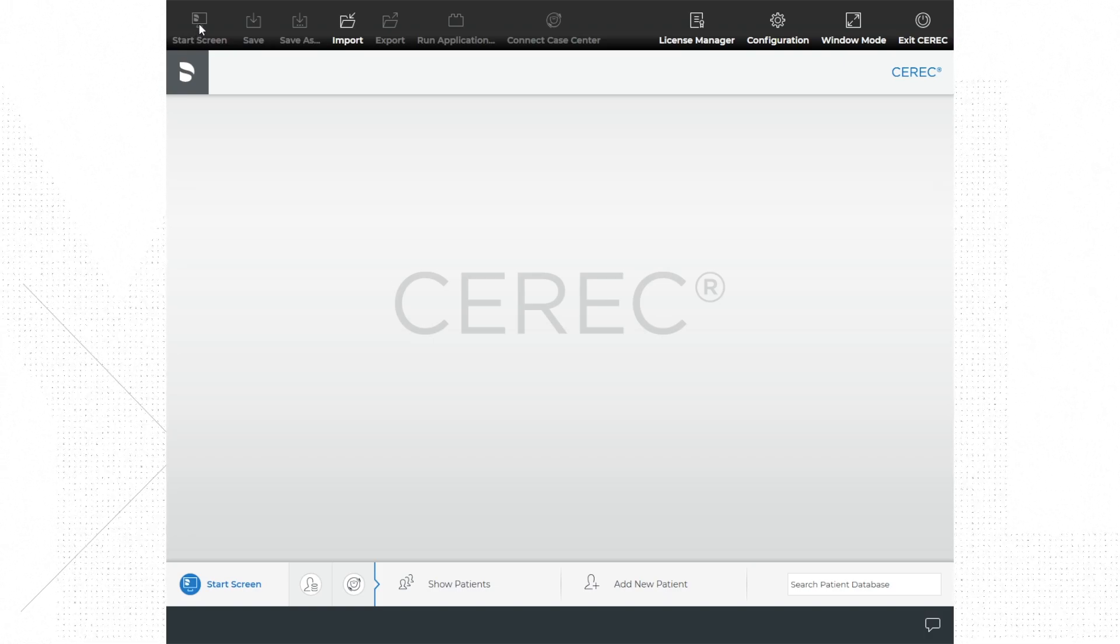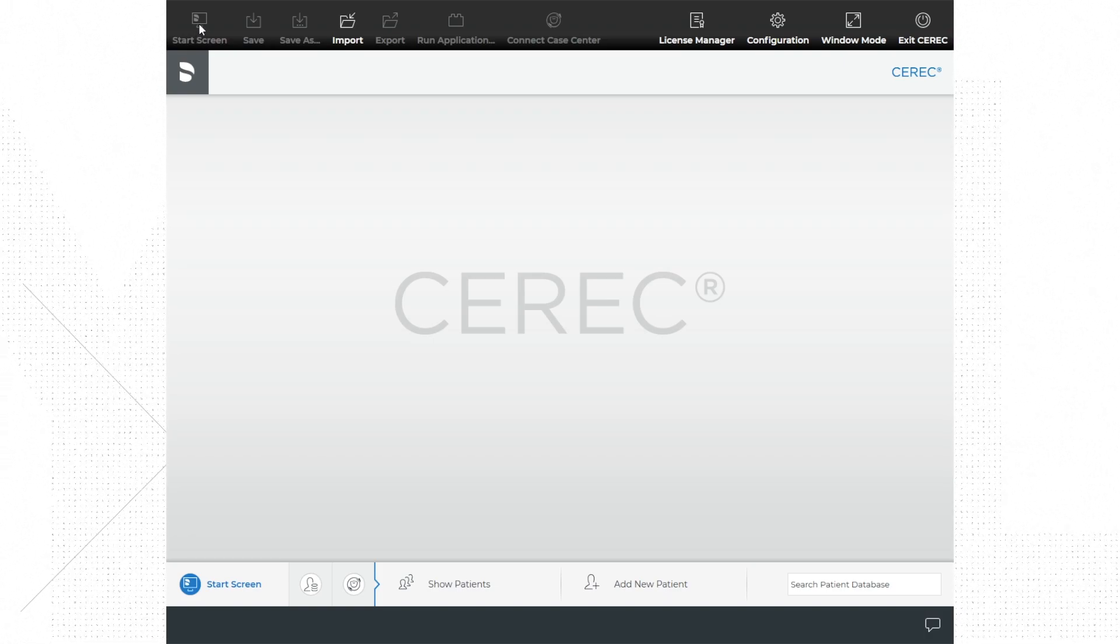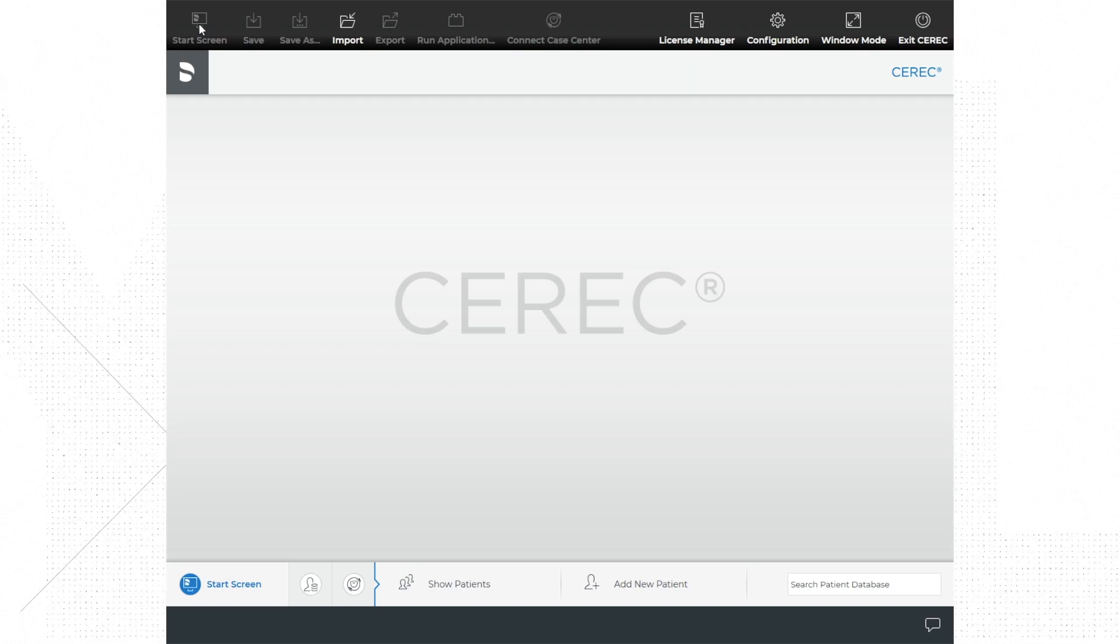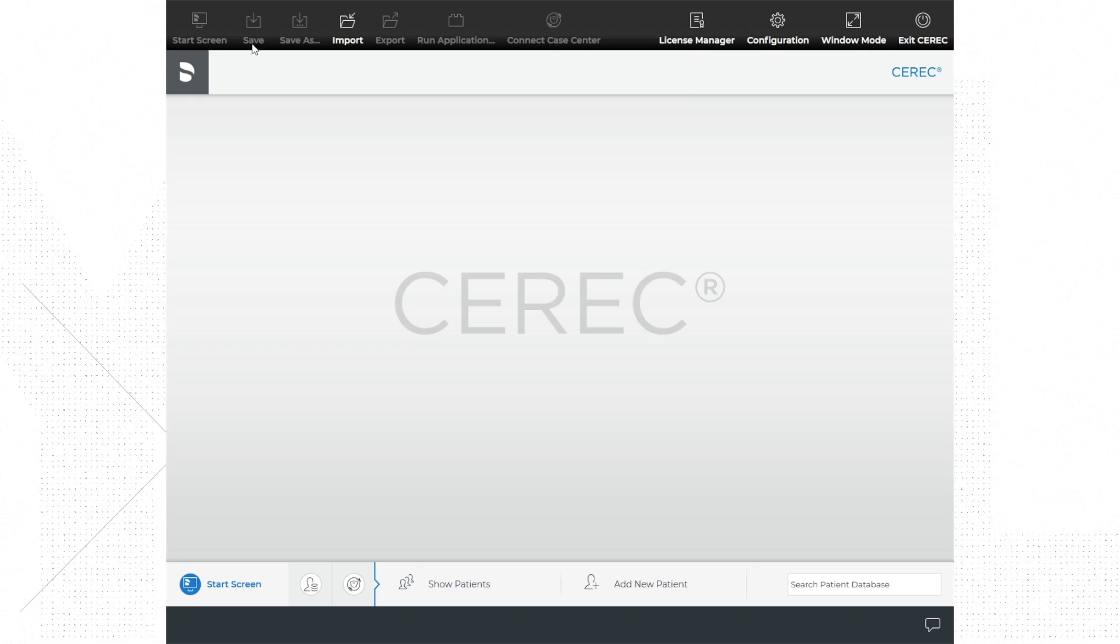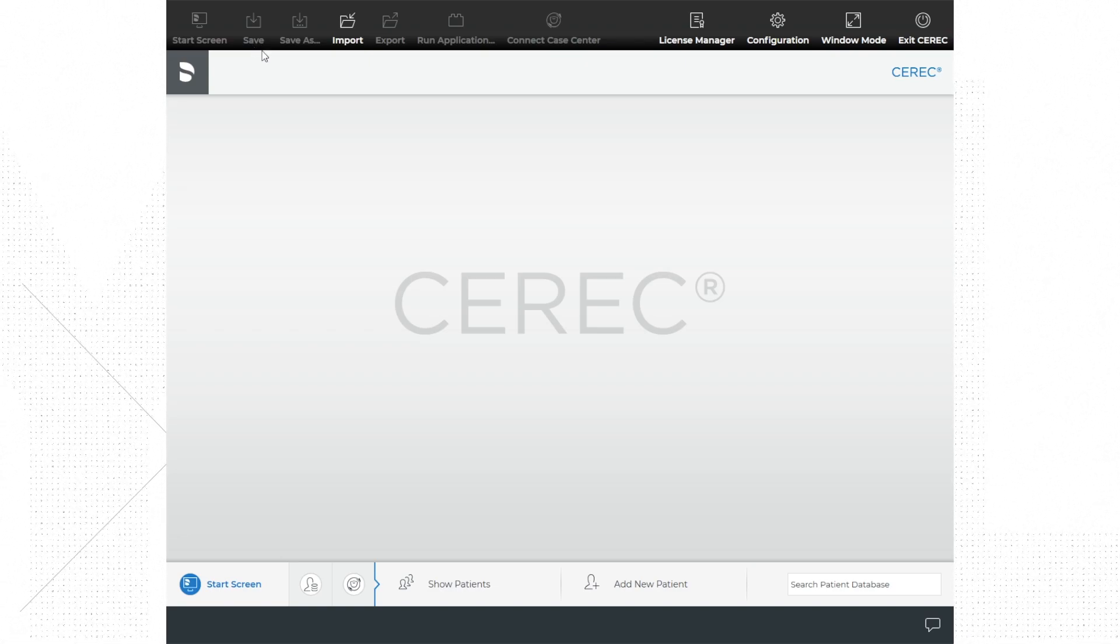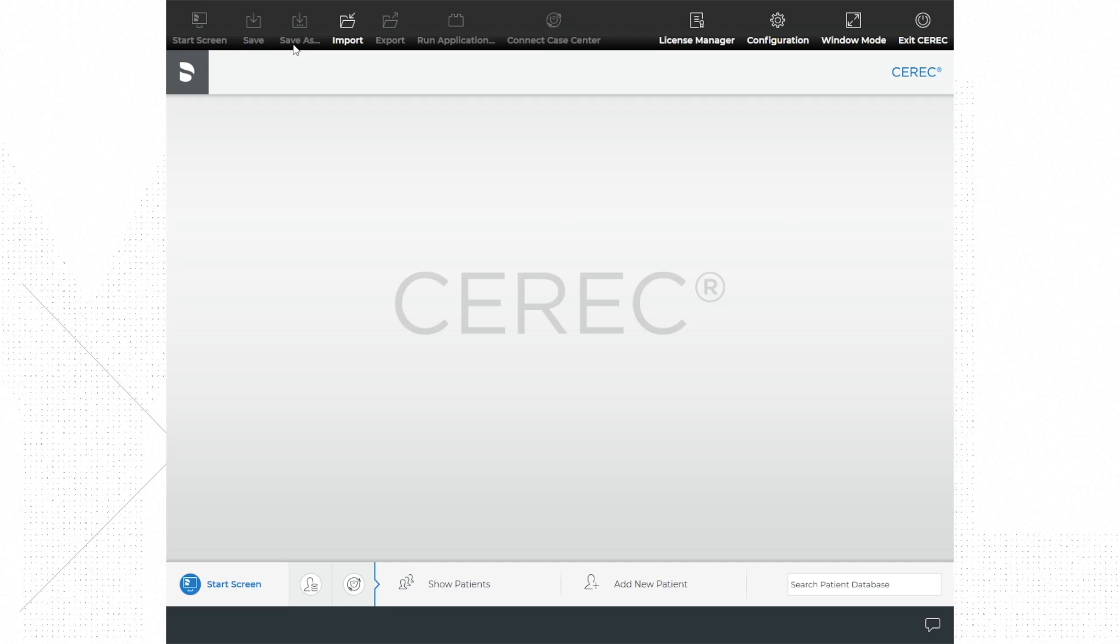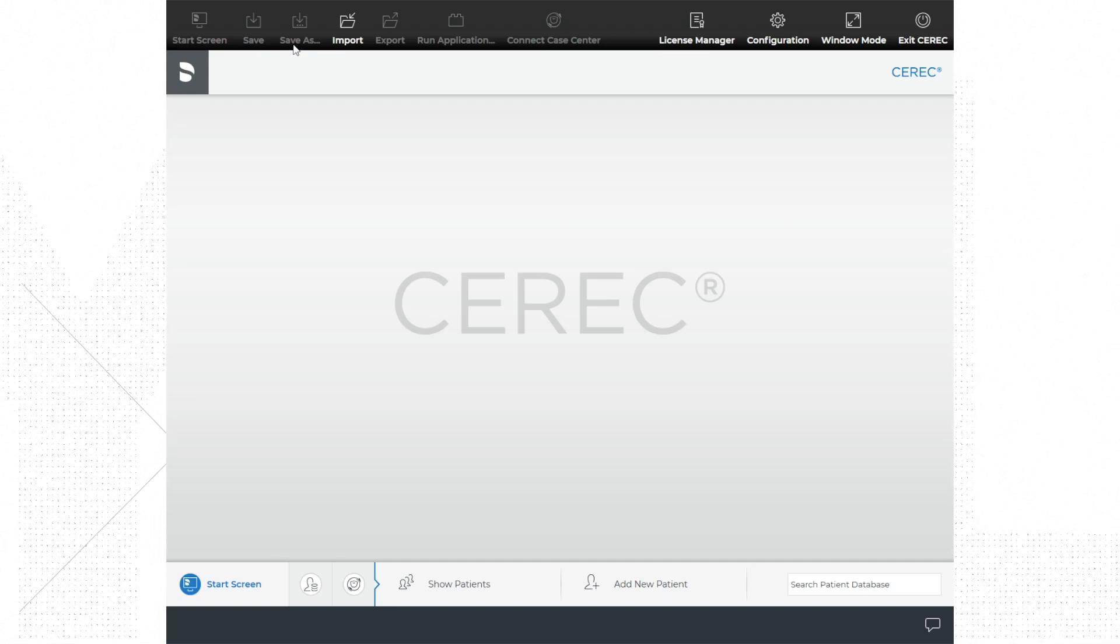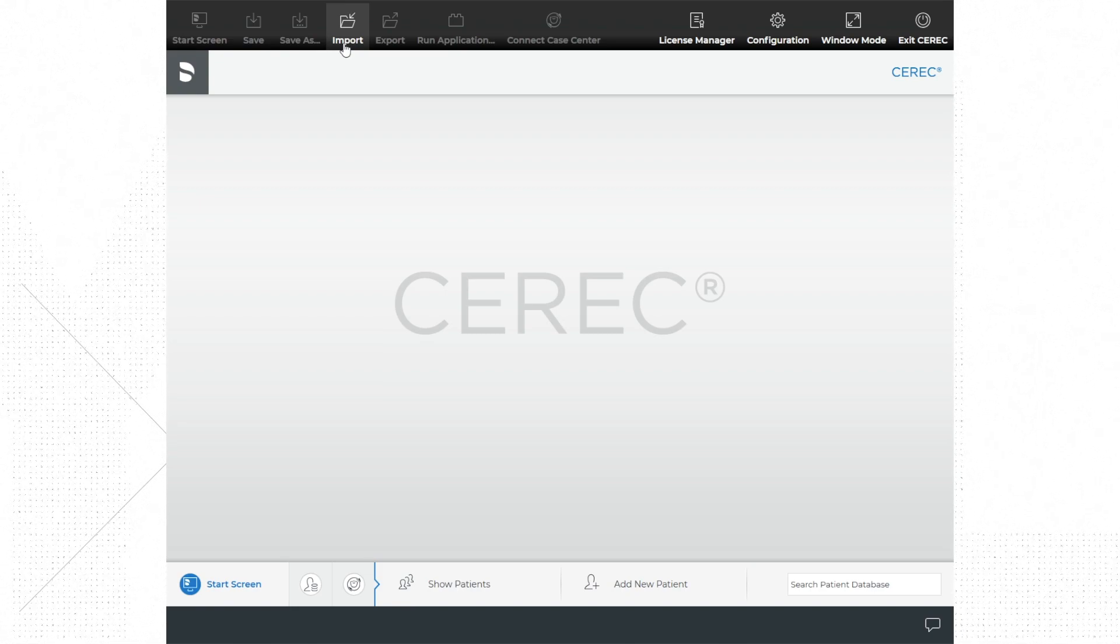Save as allows you to save the file under a new name and create a different save file. Import case will open a case saved on another drive or on the computer somewhere. Export case gives you the option to change the file type and location of save. This is helpful when you want to transfer the case to another computer or send to another location.